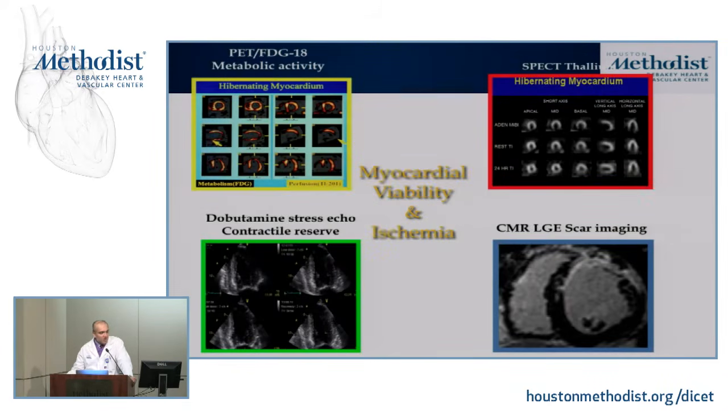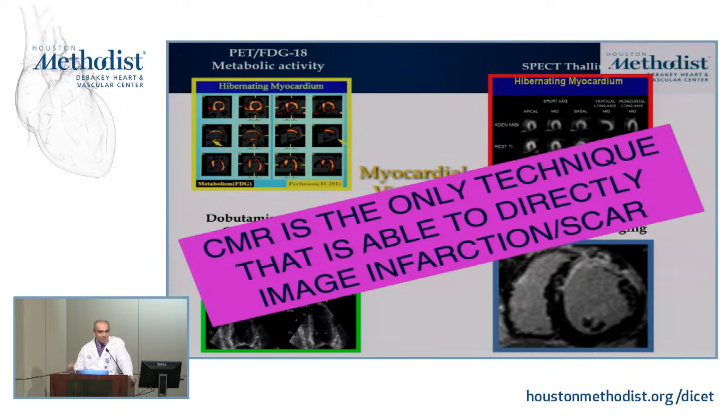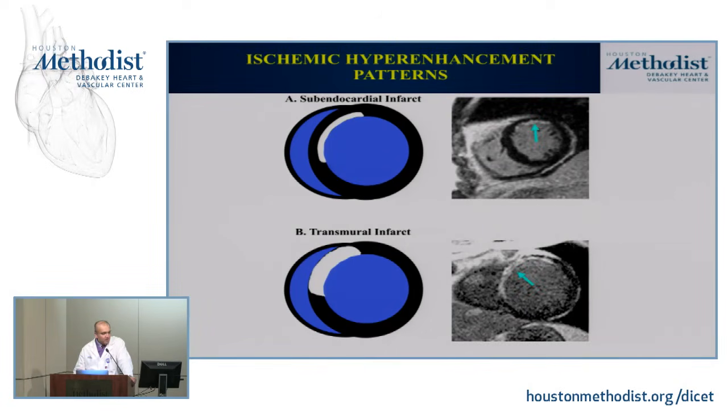Now, the next thing you want to look at is, in ischemic cardiomyopathy, we talk about viability imaging, and it's really to try to identify the presence or absence of viability and likelihood of improvement in contractile function. But we already talked about that a few weeks ago. What I want to touch on now is that there's a new angle to viability that CMR can introduce, because of this ability to directly visualize myocardial infarction or scar. And I'll show you how it's going to be very helpful in a variety of non-ischemic conditions as well. But let's wrap up here with ischemic cardiomyopathy.